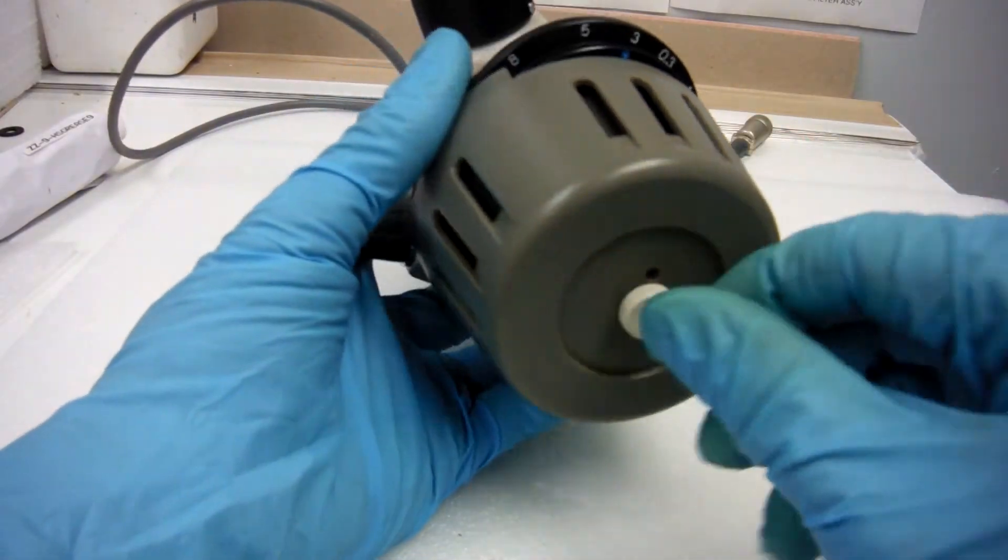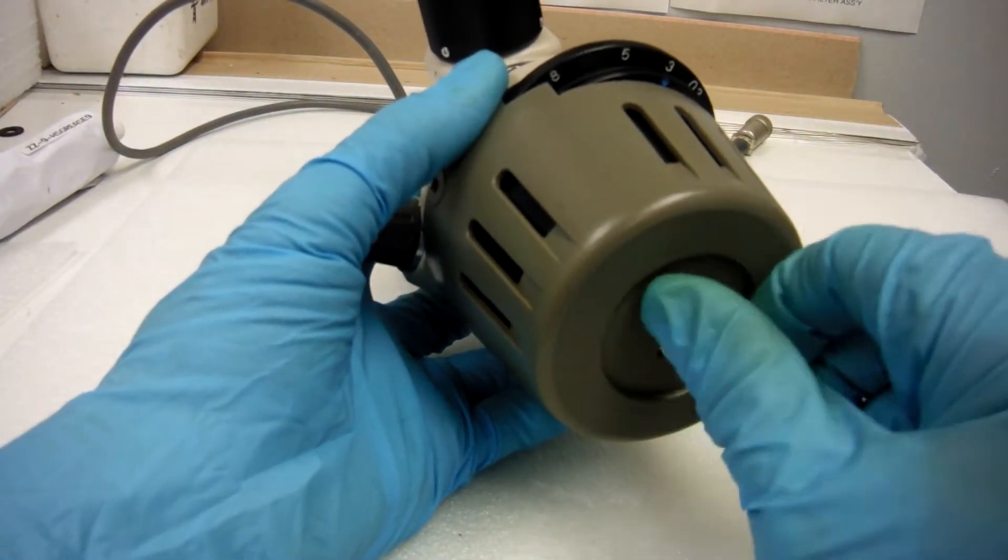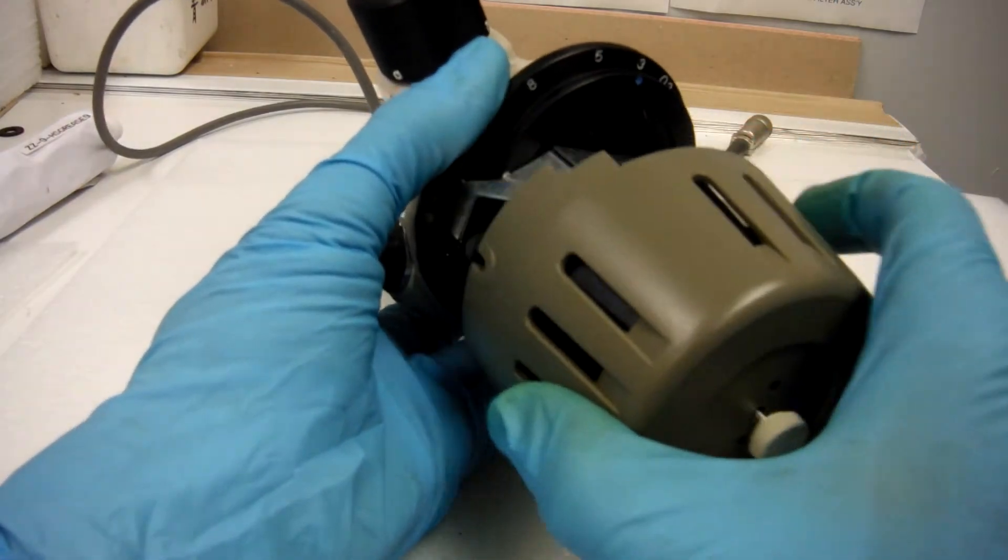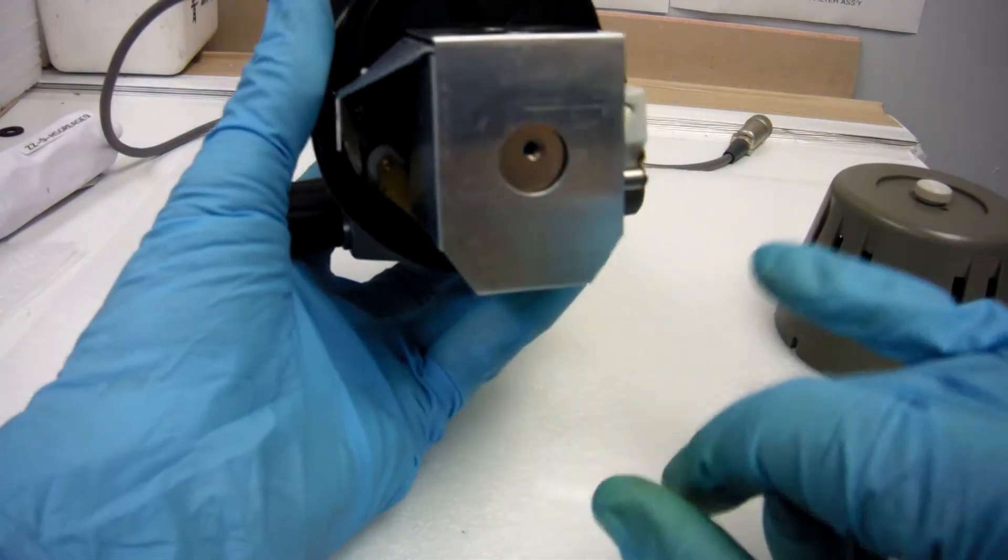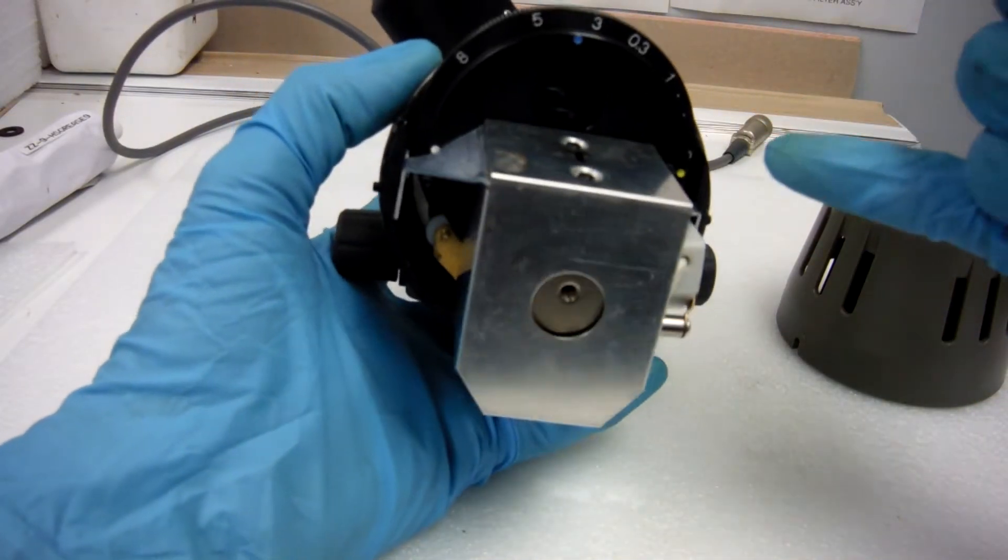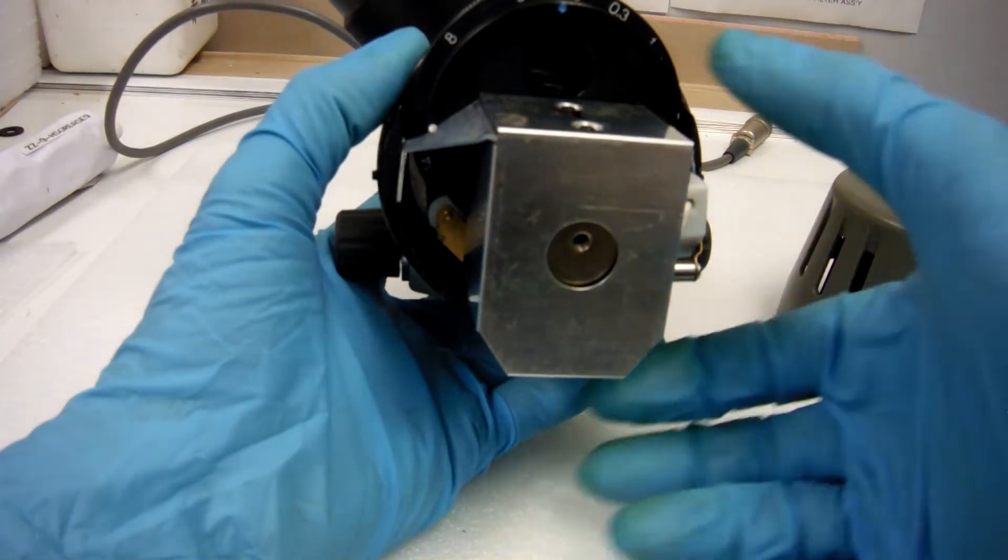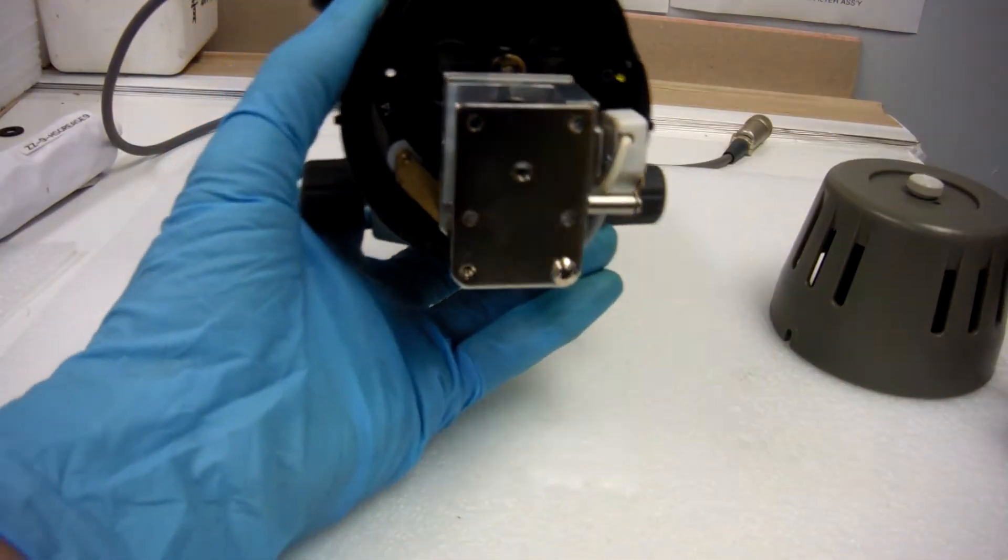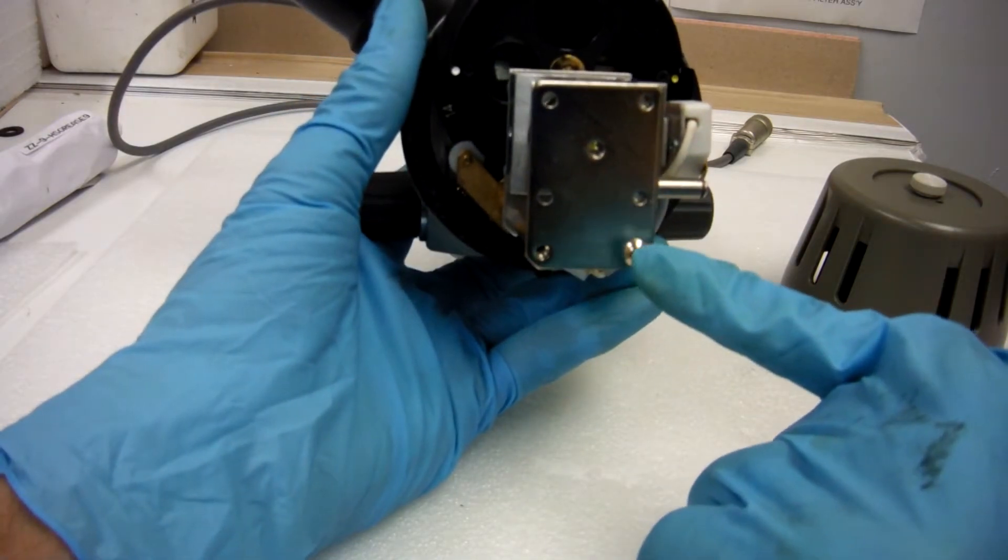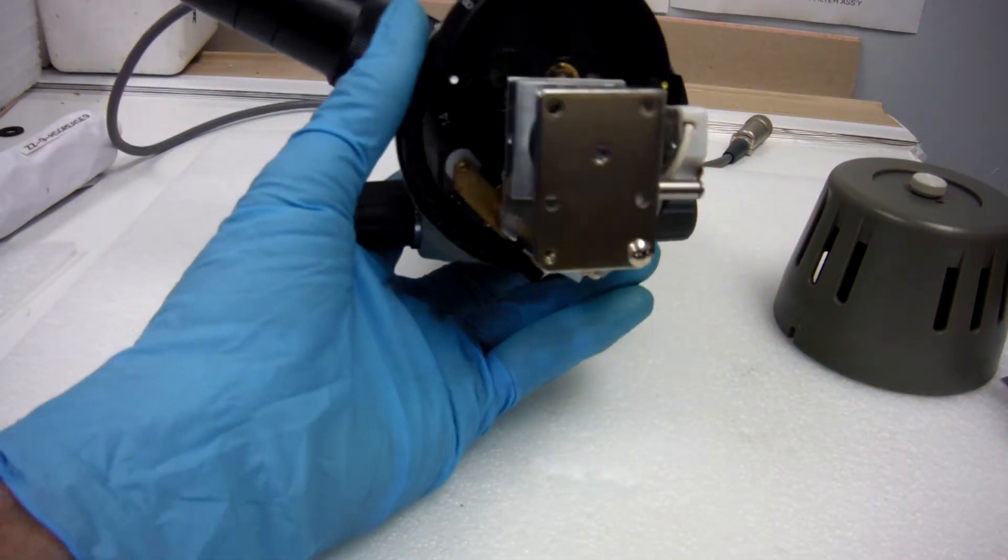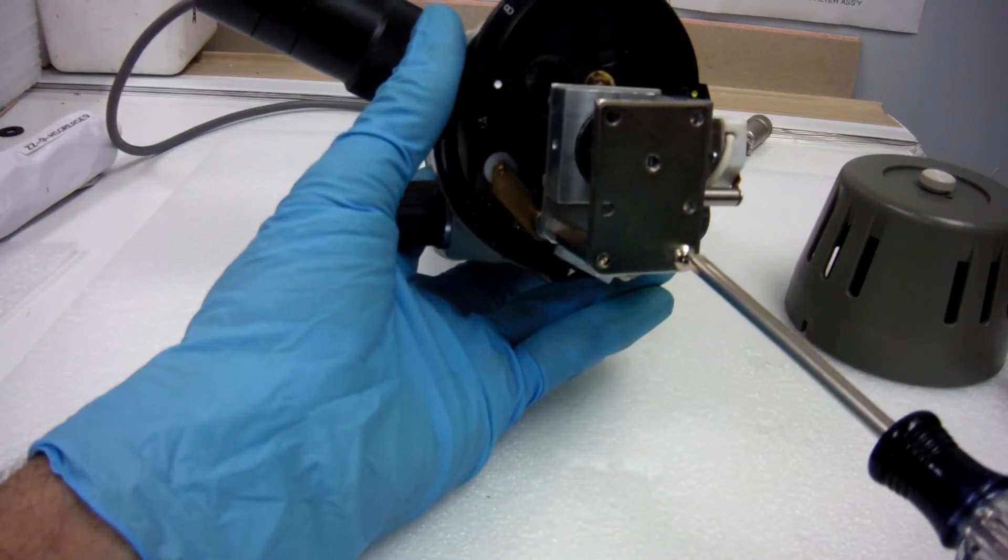Now we're going to go in deeper and take off the cover. Two screws that hold on your heat shield. Take those off. You have two screws holding this plate. Take those off.